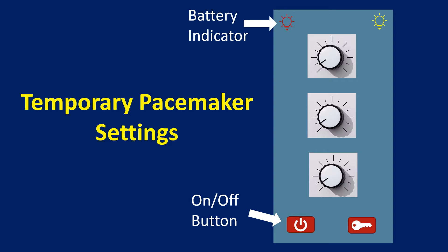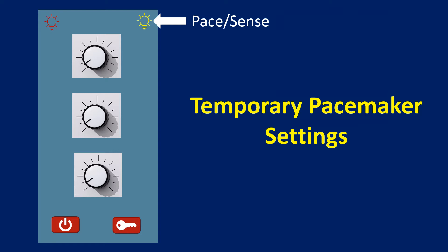We will start off by switching on the pacemaker using the on/off button. The display lights up in case of pacemakers with a display panel. In simpler devices, a power-on indicator will light up as well as a battery indicator. The pace/sense indicator will start blinking at the set pacing rate. If there is a spontaneous rhythm sensed, the color of the blinking indicator light will change to a different set color, usually green.